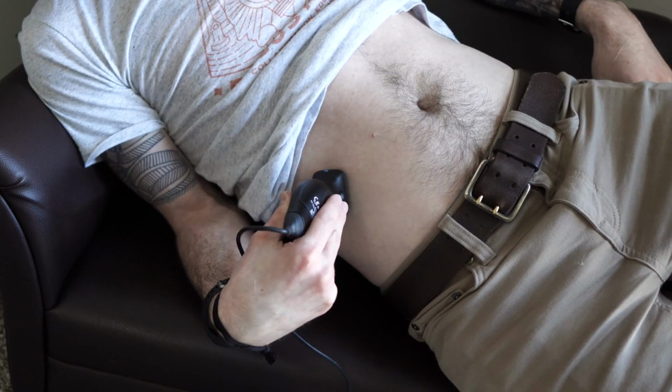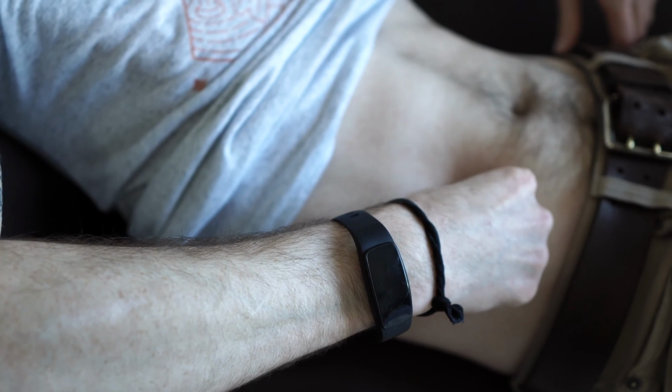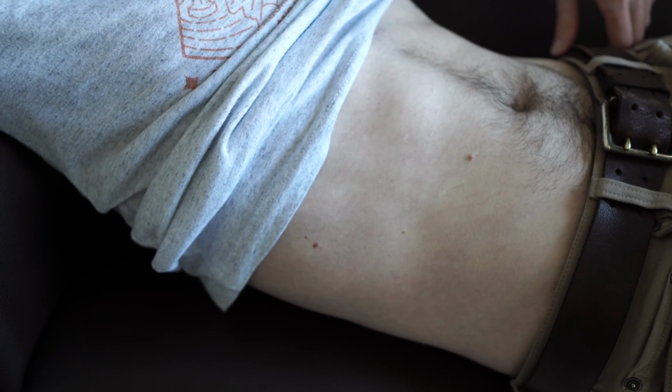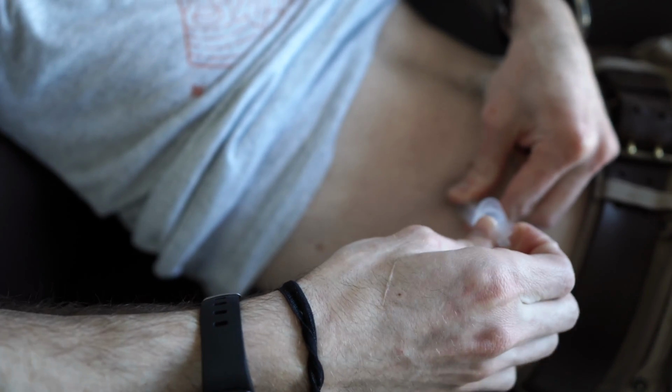Once the deepest pocket of fluid is identified, the operator should freeze the image and then mark the skin in some way to indicate where this image was taken. This can be done with a skin pen or more temporarily with a fingernail or even an empty syringe.